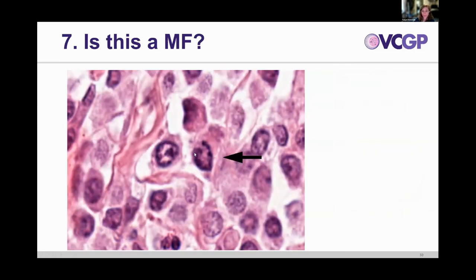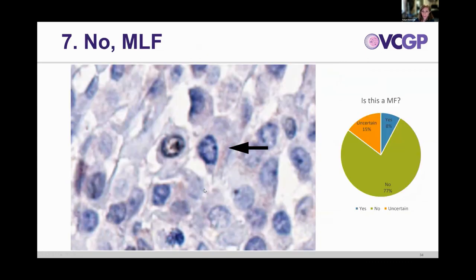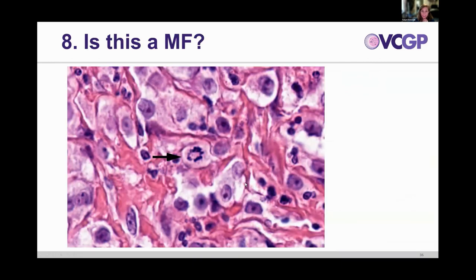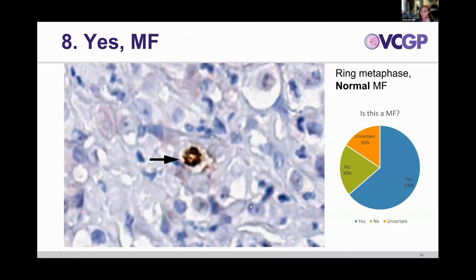The next one, also a little blurry, is ring-shaped and smooth with no spikes — it kind of just looks like a nucleus with a nuclear membrane, similar to the cell right next to it. This is negative on PHH3 — most of the crowd picked that this was a mitotic-like figure. The next structure had a little less consensus: it is another ring shape, but it's spiky — we have a ring shape, rods and spikes, and a pale cytoplasm. So this is consistent with a ring metaphase.